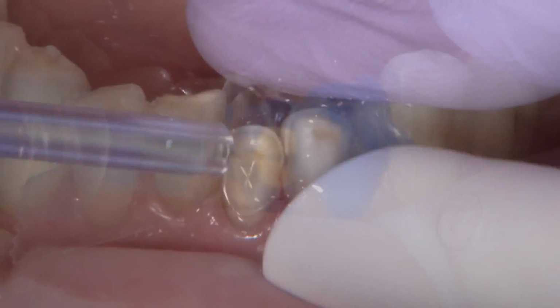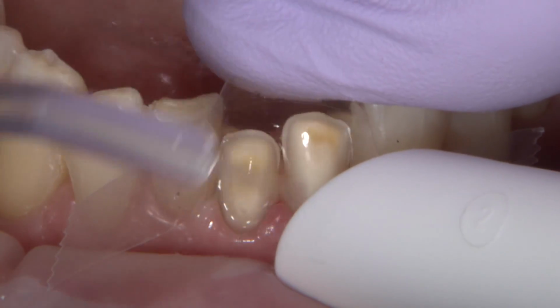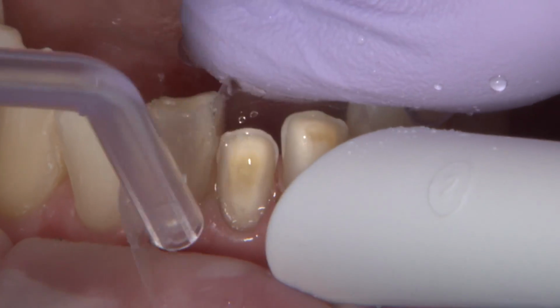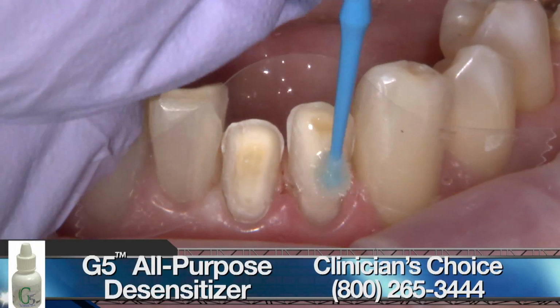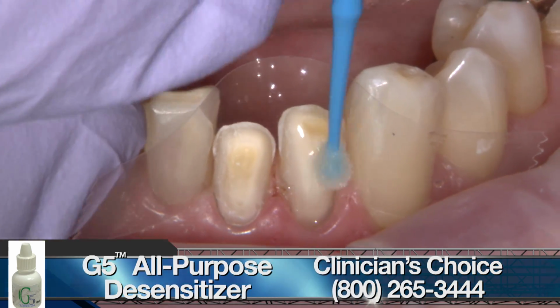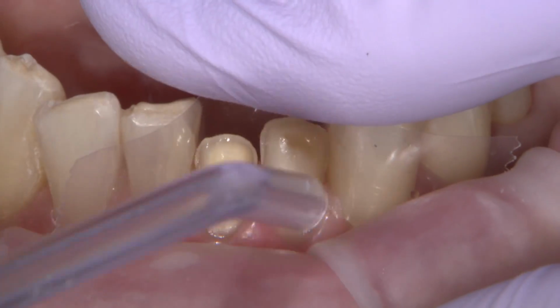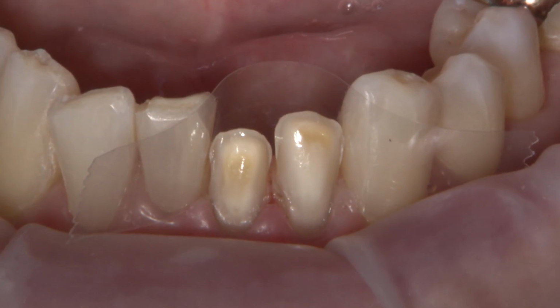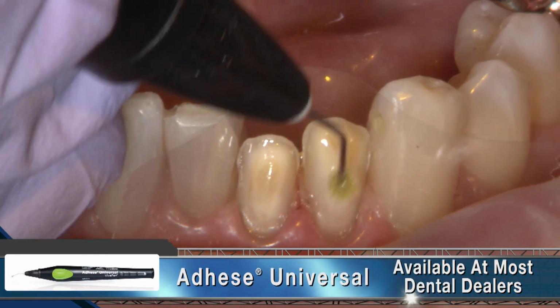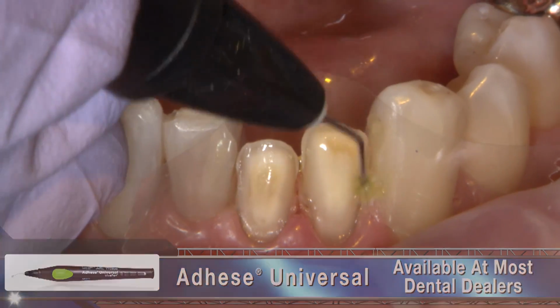on the preparations where we condition the preps with phosphoric acid and then a very light application of G5 desensitizer, and we scrub that slightly into the dentin, and we follow that with our bonding agent. In this case, we are using Ivoclar's Adhese Universal, which has a unique pen dispenser that helps minimize waste.